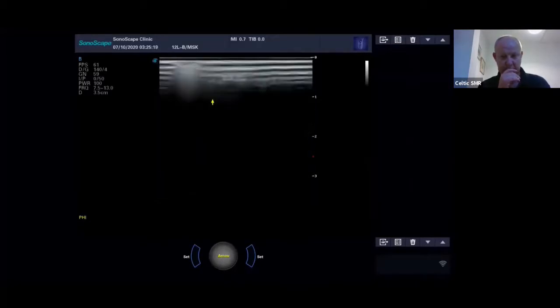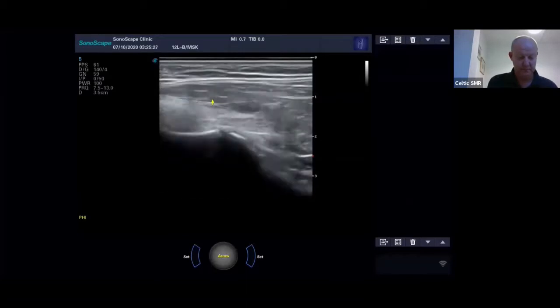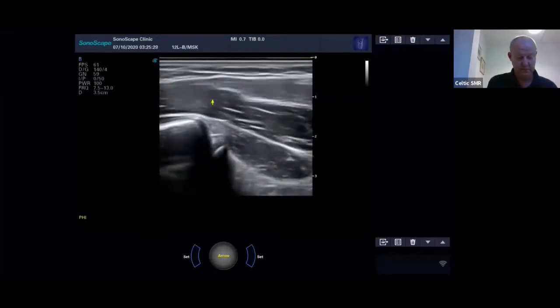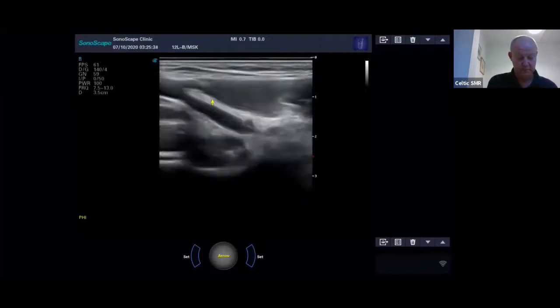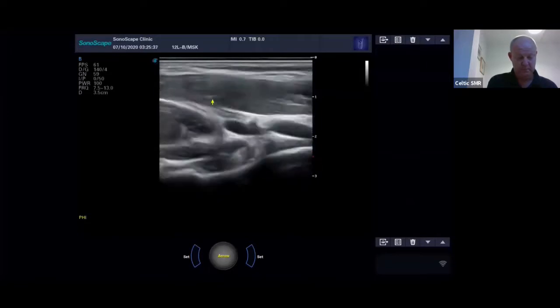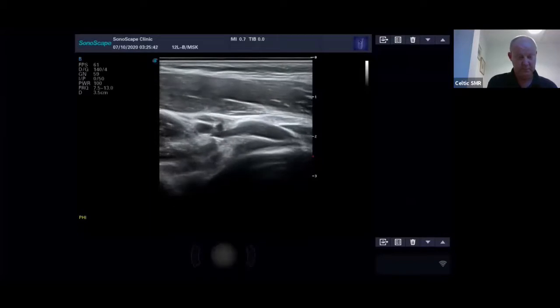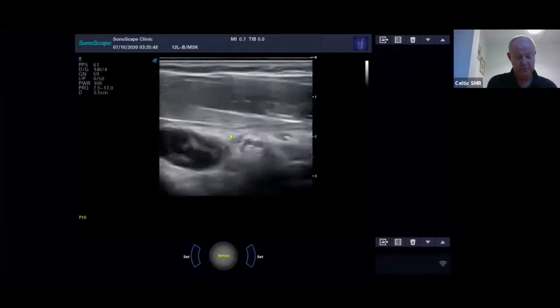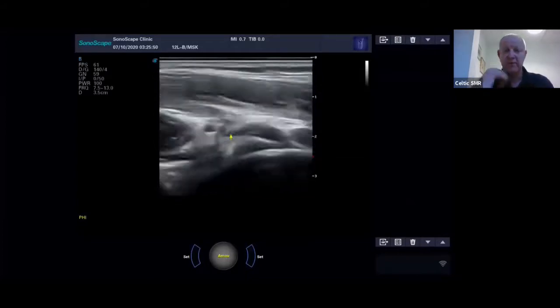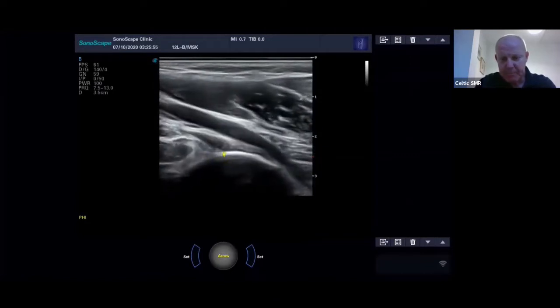So what I tend to do is come down immediately and place the top of my probe on the medial condyle, and then come in until I see the bone here. Let's just get this one. There's the arrow there. And it is very fiddly. A great image, though. Yeah, so here you go, it's attaching here.